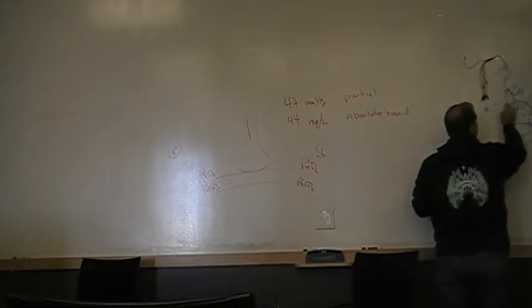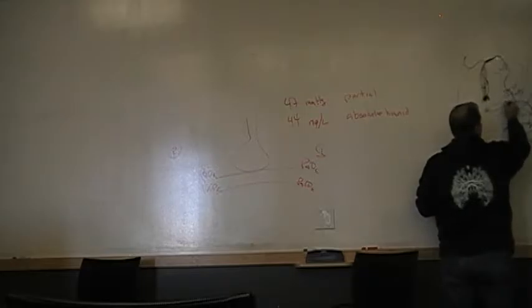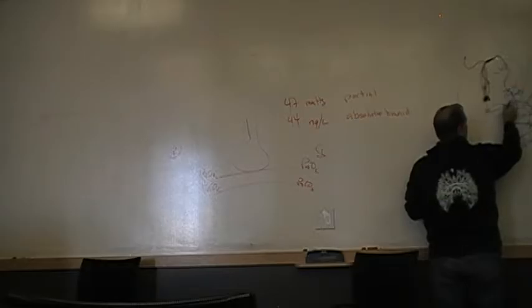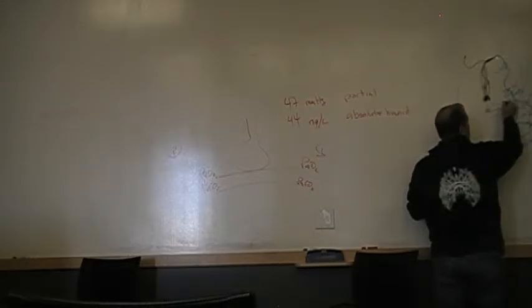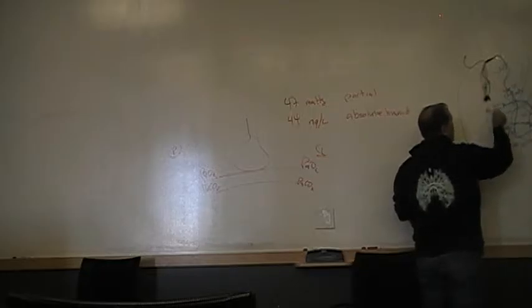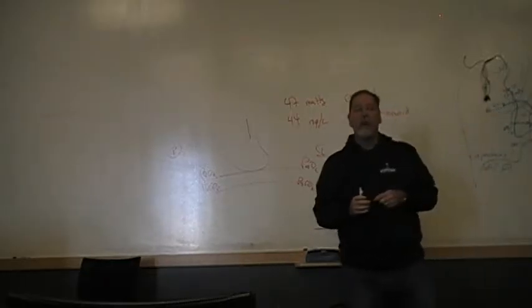Eventually we come to a place where this catheter is occluded, in what I've drawn as the balloon there. So the balloon occludes this vessel, and from this point on, there's no more blood flow.